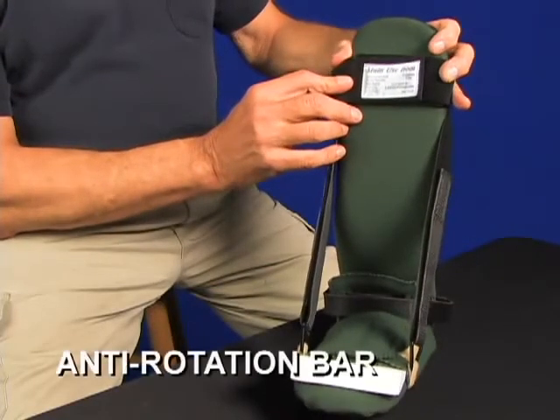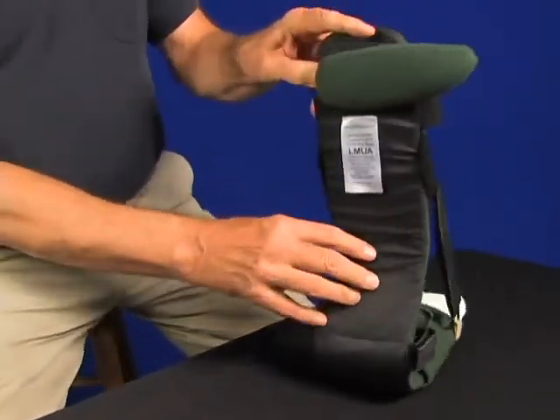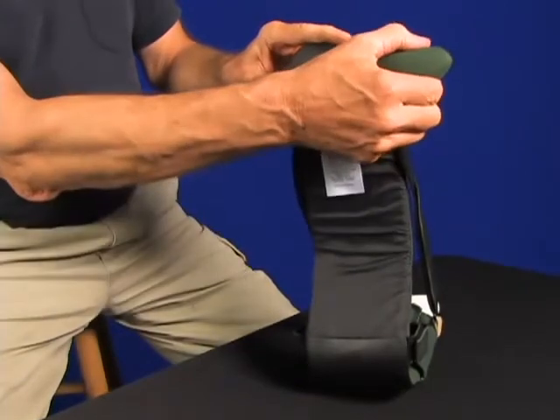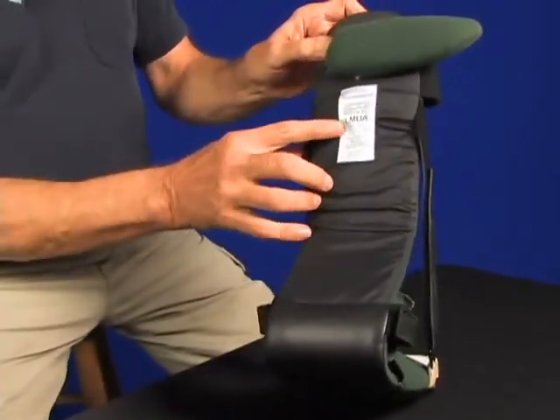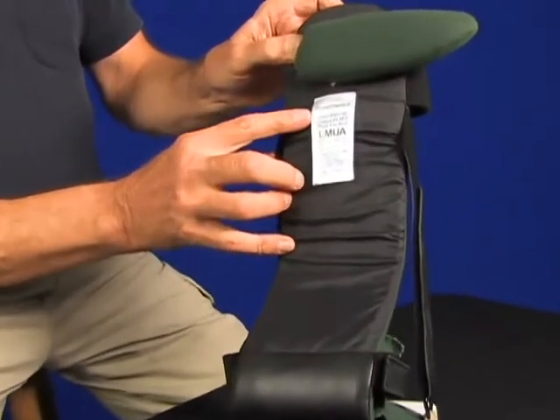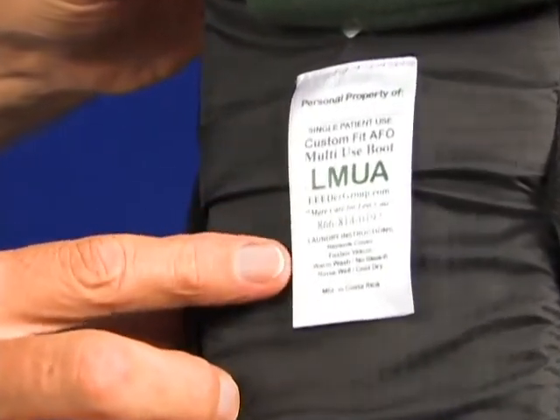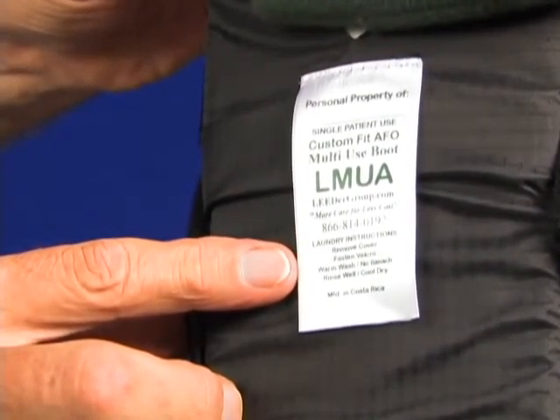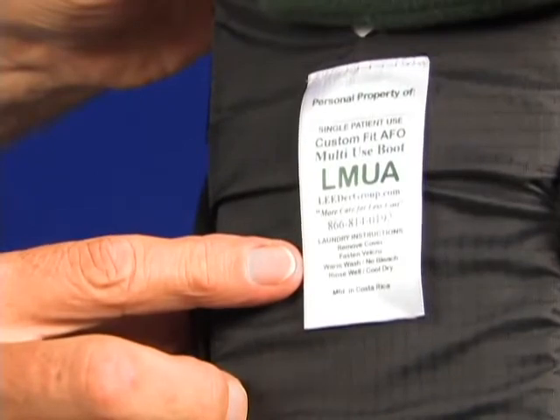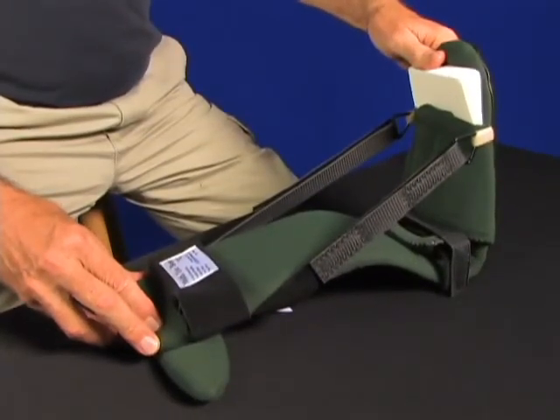This is the multi-use boot with an anti-rotation bar. The night splint does not have an anti-rotation bar. The multi-use boot is just that — it can be used for many different conditions: plantar fasciitis, multipodus for heel decubitus, floating the heel, eversion, and inversion. The multi-use boot, LMUA. Here you can see how the anti-rotation bar counteracts rotation.